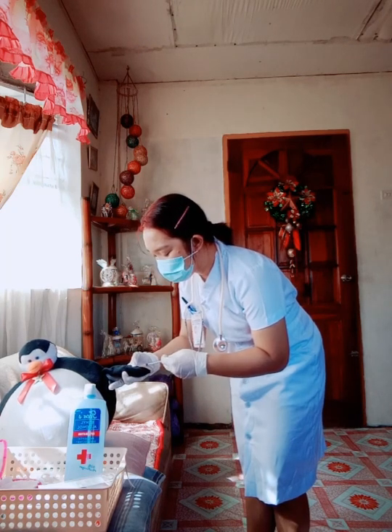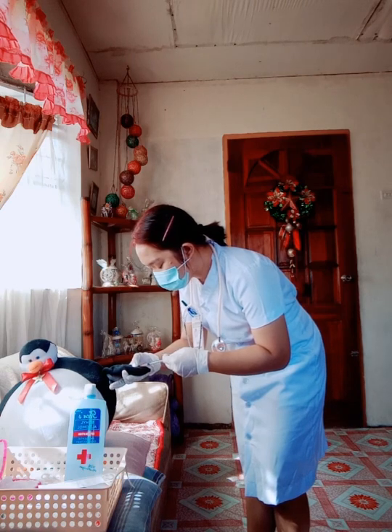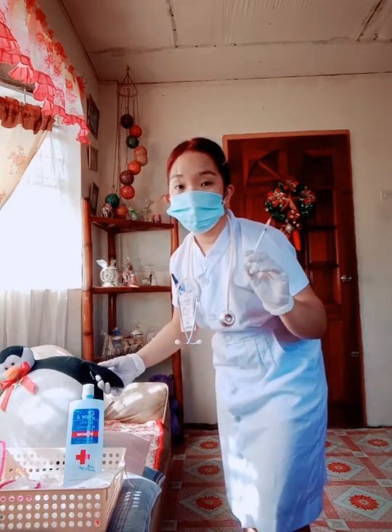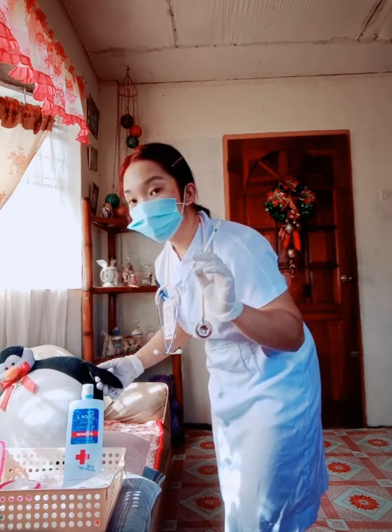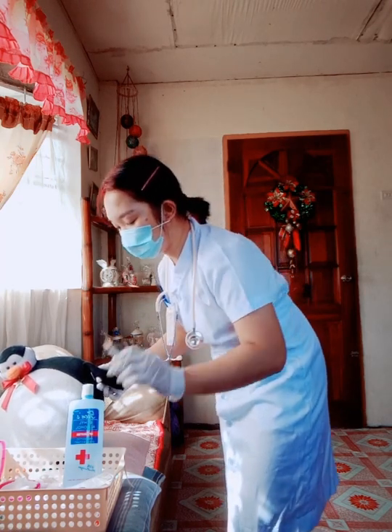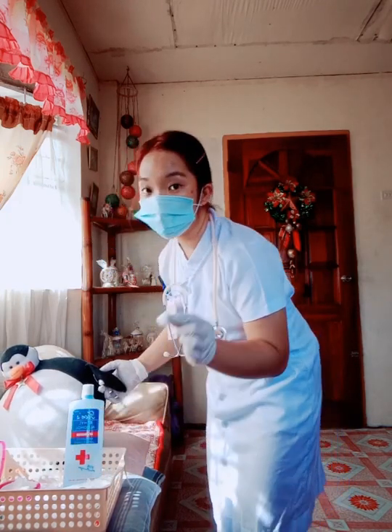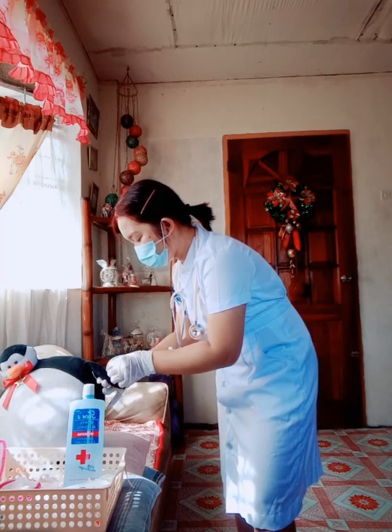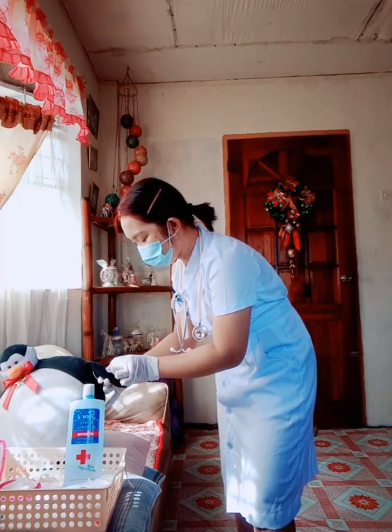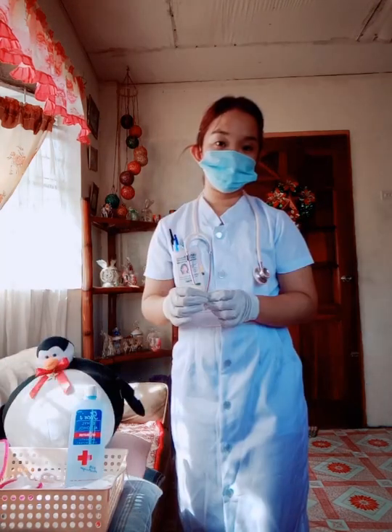After injecting the medication, we can now withdraw the needle at the same angle of insertion. Apply gentle pressure to the site and please do not massage it. Get a clean and sterile cotton swab. Apply it to the area with a small and slight pressure on it.